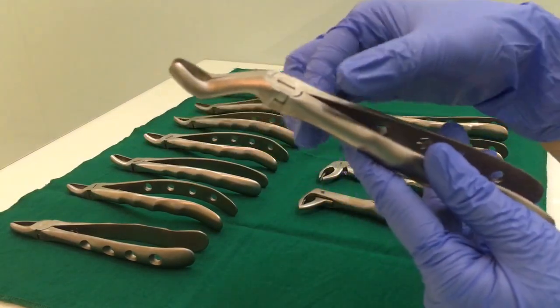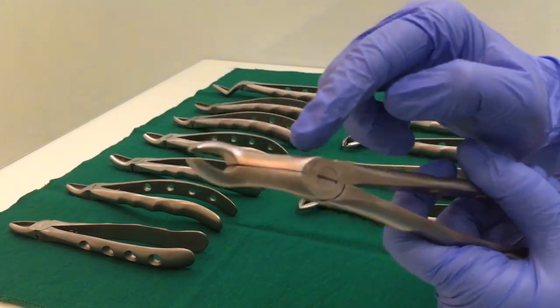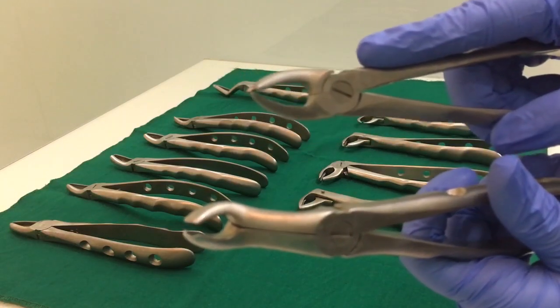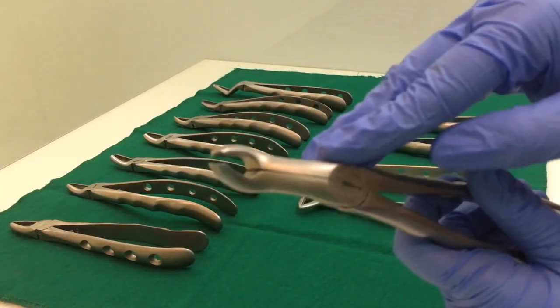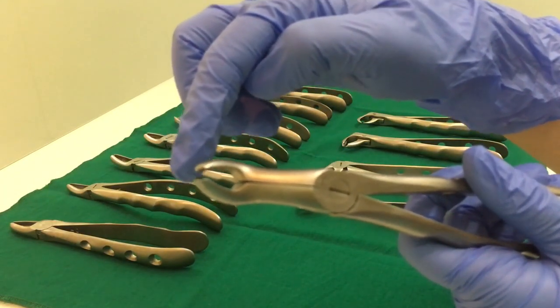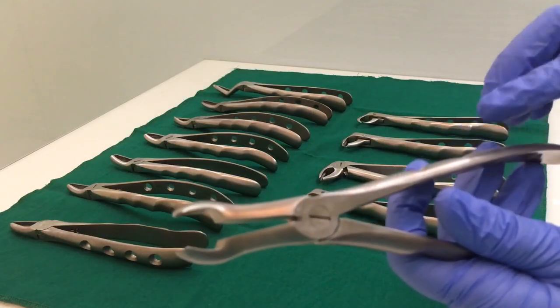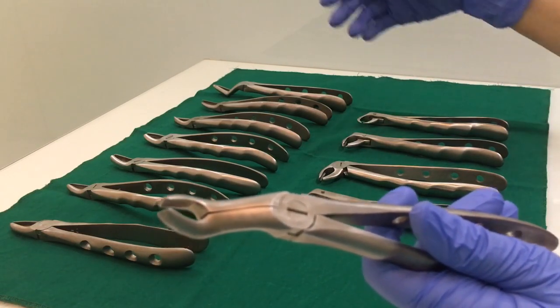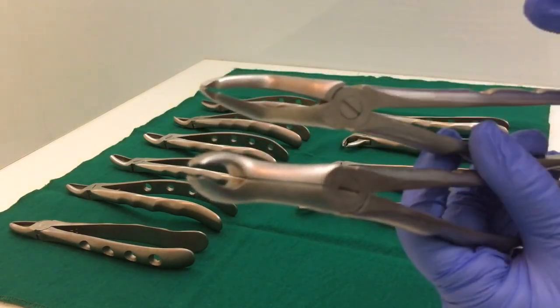The last upper forcep is the upper third molar forcep. Like the upper root forcep, it has a very long beak — longer than the rest. But the difference between the root forcep and this third molar forcep is that there is a gap in between the two beaks at the end. Also, the beaks here are rounded, not pointed. This is used for getting a very nice grip on upper third molars, which are really inaccessible.